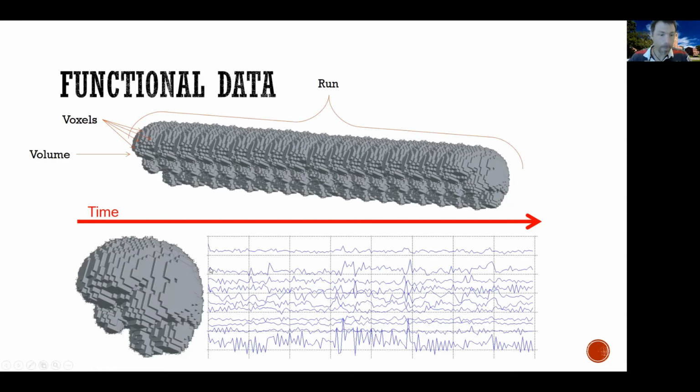And the second row is the values of a different voxel at each of the TRs, et cetera, et cetera. So sometimes it will be handy to think about a functional data set or a run of data as essentially a set of pictures of the brain over time. Other times, it will be more handy to think about these data as time series, where each voxel has a time series of values over time. They're the exact same thing, I'm just portraying it in different ways.